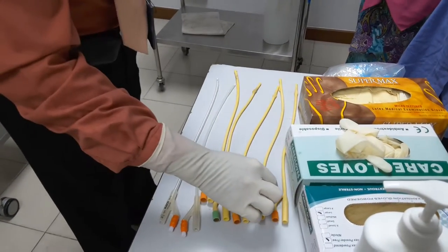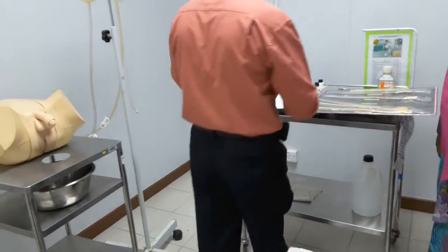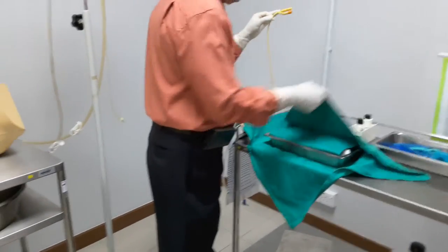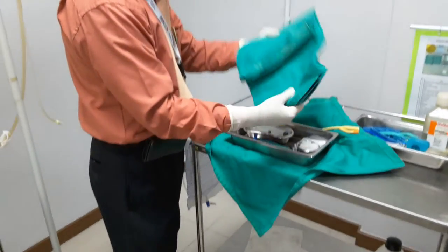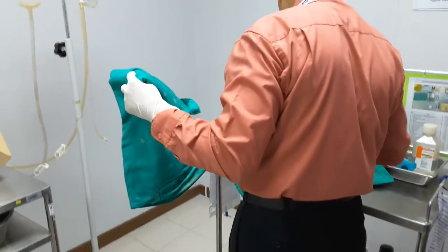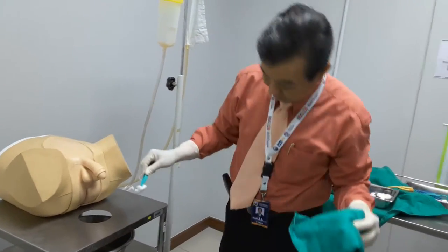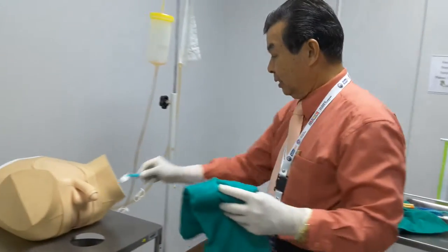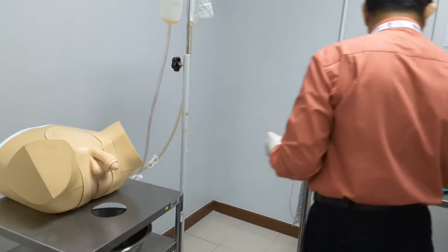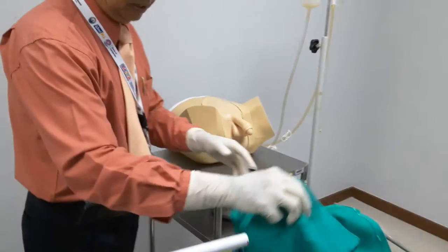This is the sterile one — my assistant may help me open up the folded drape. I keep the sterile field intact. Before inserting, I'm going to wash using this — clean from the center to the periphery. Repeat this several times. Then I can hold this part and position myself on the right side.